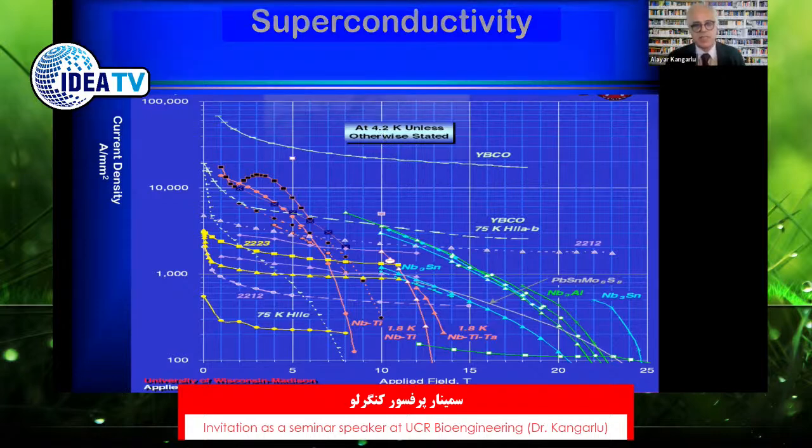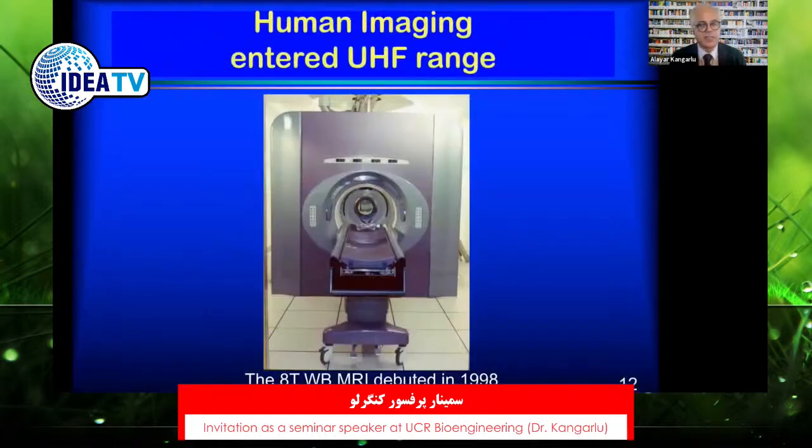Helium is a precious element and it is not abundantly available. The helium that we are extracting from Earth, once it's used up in all these MRI scanners and high energy physics research labs, once it's released into the air, is unrecoverable. And that is really a big blow to scientific research for generations of the future. And that's why high temperature superconductors are such a desirable, useful, environment friendly and commercially feasible technology for the future generation of MRI scanners.